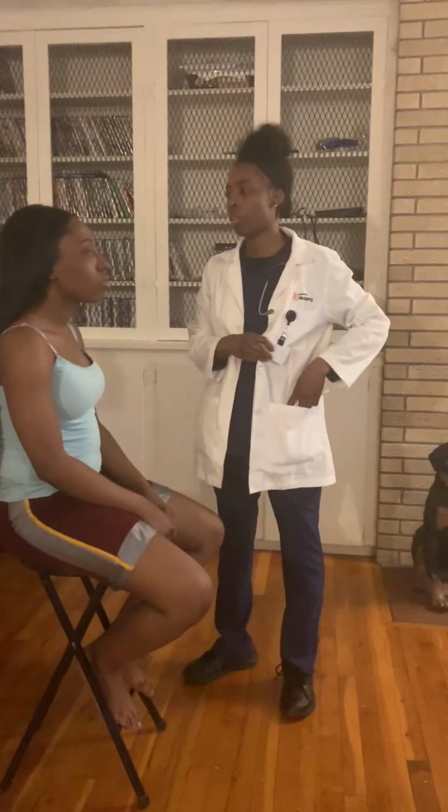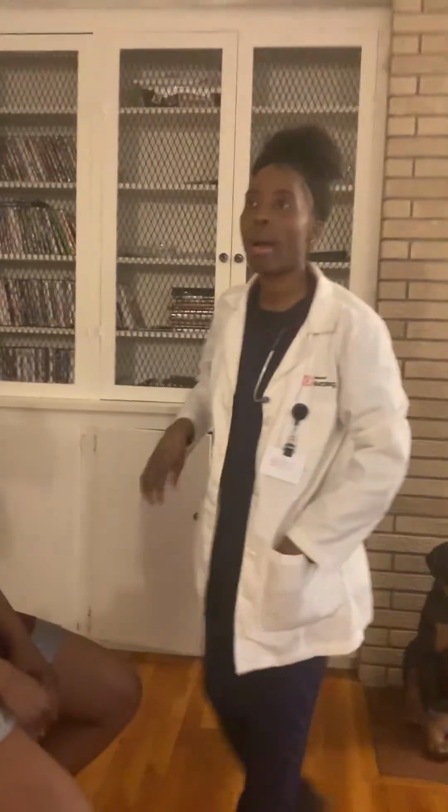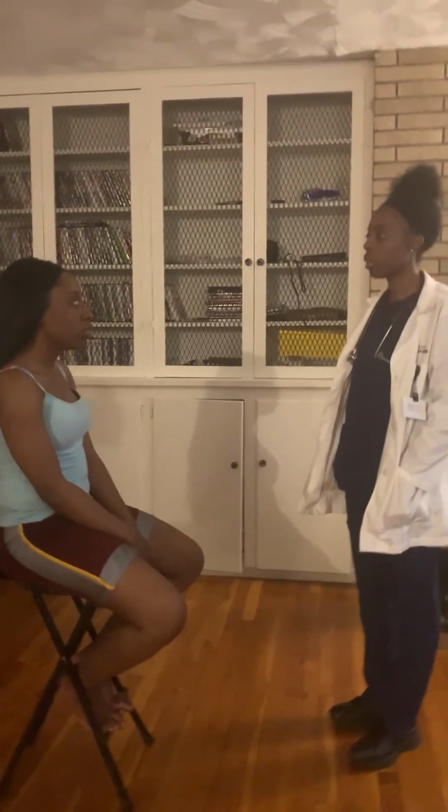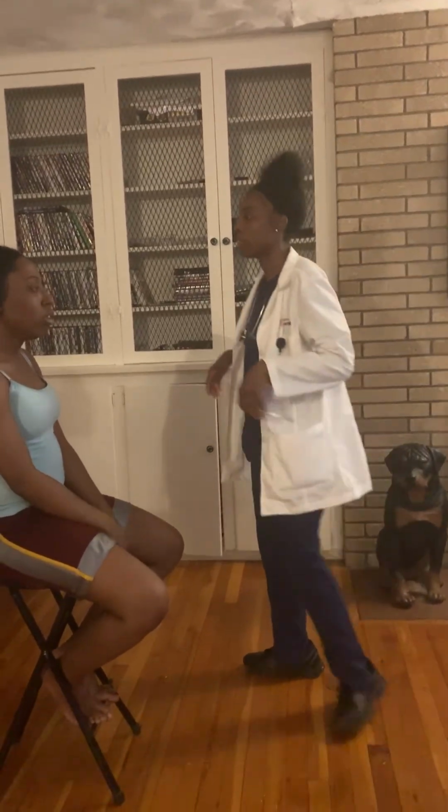Now I'm going to check my patient's ears. Do you have any problems with hearing? No. All right. Do you have a history of ear infections? No. All right. Do you have a family history of ear infections? No. Okay. So I'm going to check into my patient's ears.